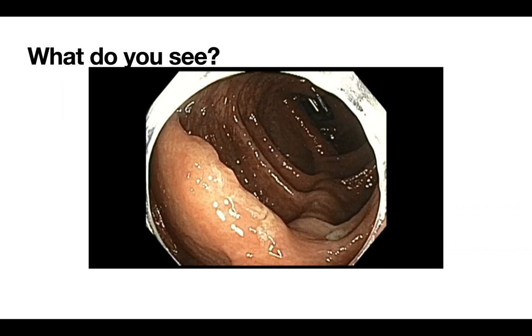Those things have to be aligned, and that is something I'm always concerned about when suboptimal preps come. The second comment I have in that context is, when there is a suboptimal prep, like in this patient's, the way it is appearing, bubbles can be cleaned with copious amounts of lavage if we can do that.